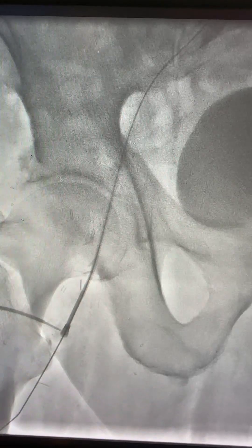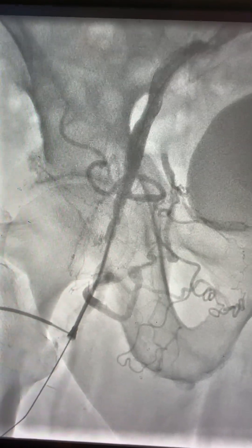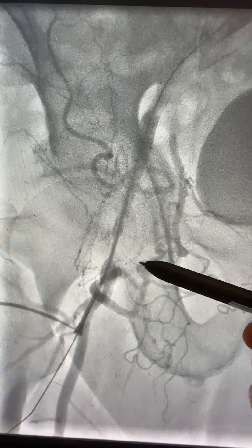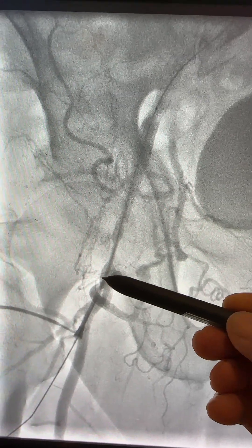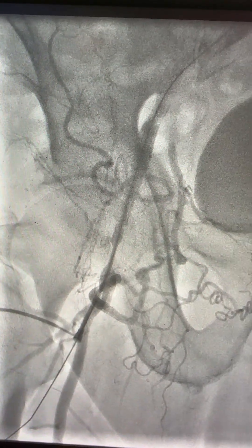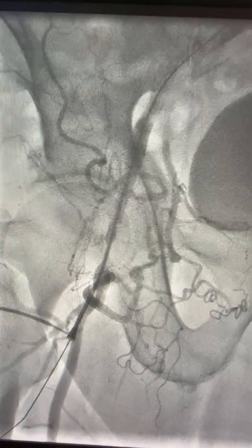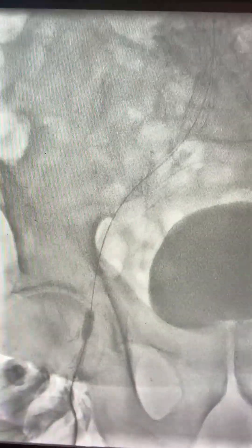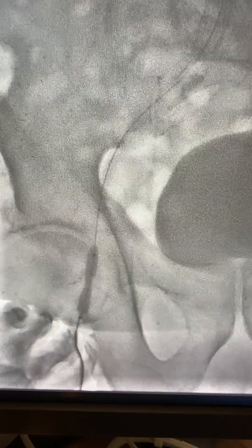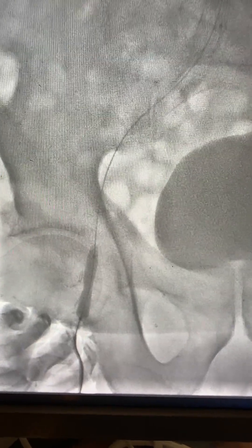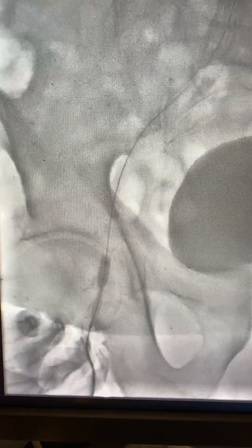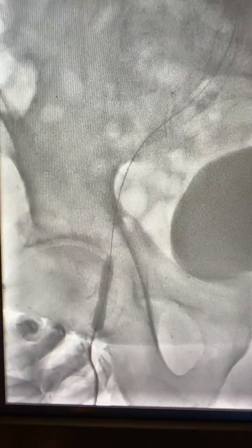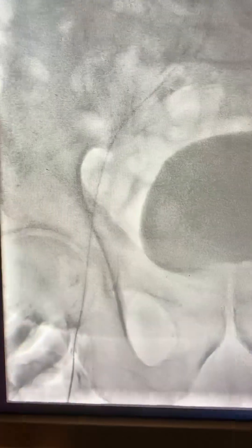The options for treatment here are either going from the other side or, as we'll do here, keeping the sheath in place and advancing a 7x40mm balloon through the sheath. Then pull the sheath while holding pressure so the sheath is outside the body, and perform inflation at nominal pressure. Here is my hand holding the sheath and the balloon — we inflated the 7L x 40 balloon at nominal pressure and then used the balloon as a dilator, advancing the sheath back over the balloon.